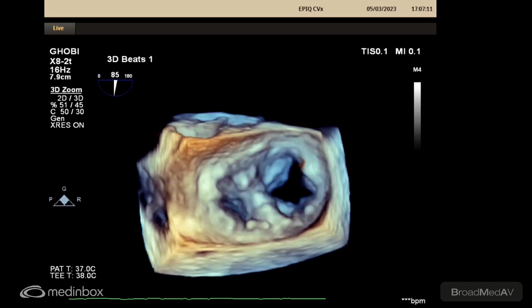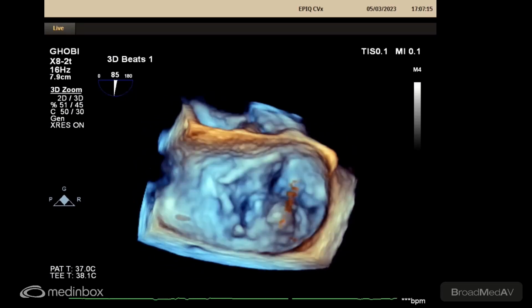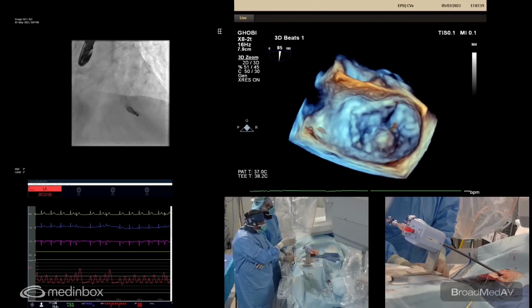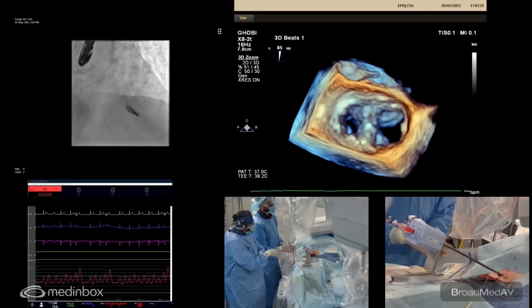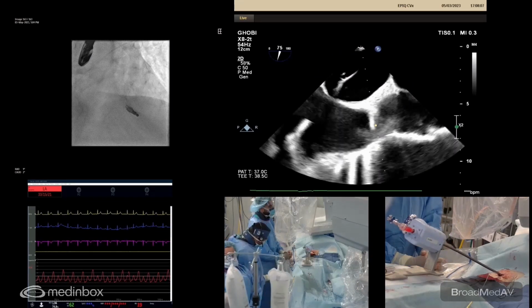Yeah, that's a big prolapse segment there. I agree with you. I think when you had tension in the system, you can really appreciate it now, right? So we should go right up and down in the middle there with one XTW. So we are going quite well.